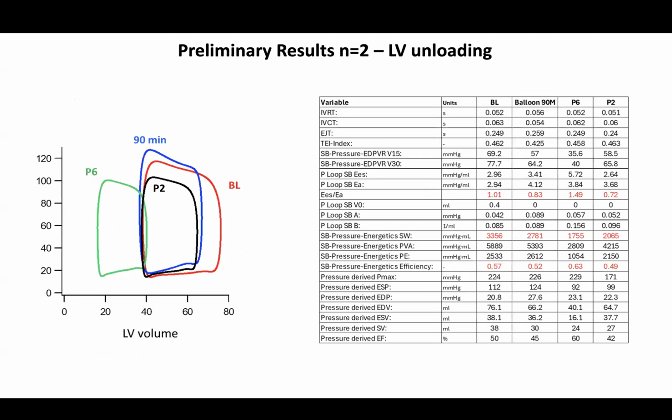And this is another PV loop that we just did, looking at the same thing now at different speeds and looking for a threshold of what should be your performance level. We will never use an Impella P2, right? So that's when you're about to disconnect. But the question is whether P4 and P6 and P9 will provide similar or equal support, and you'll try to reduce the risk of complications, mainly hemolysis. Right?